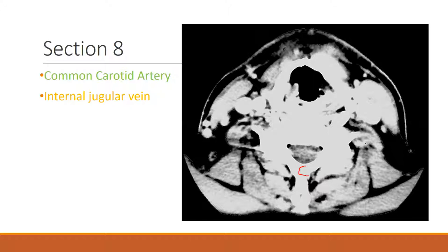All right, so we're going to find the common carotid artery, which lies right next to the internal jugular vein. Now, keep in mind, arteries come away from the heart. They're under high pressure, so they tend to be a narrower diameter. Veins are low pressure and are returning to the heart, but of course what goes into the heart must equal what comes out. So the way veins keep up with arteries is by being a larger diameter. Since they have lower pressure, they make up for it by having a larger diameter to carry a larger volume of blood. And that way, what goes into the heart by way of veins can keep up with what comes out of the heart. So why did I say all that? Well, when you're looking at a cross-section, a smaller structure, a circular structure, is likely to be an artery, and a larger diameter structure is likely to be a vein. So I've just highlighted the common carotid artery there in green. And then its paired vein right next door is the internal jugular vein, which you'll note is a larger diameter.